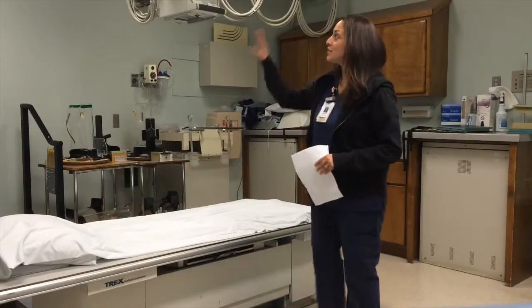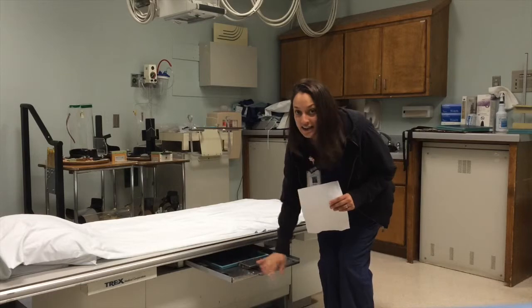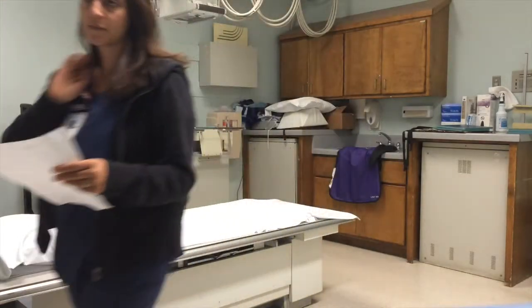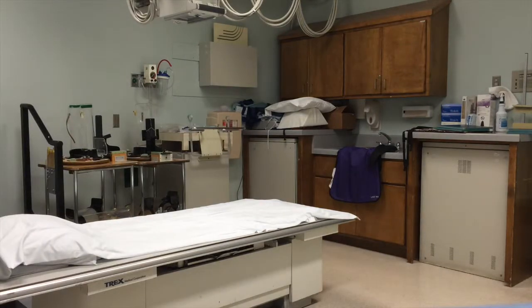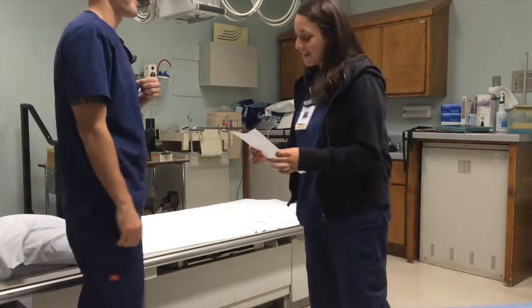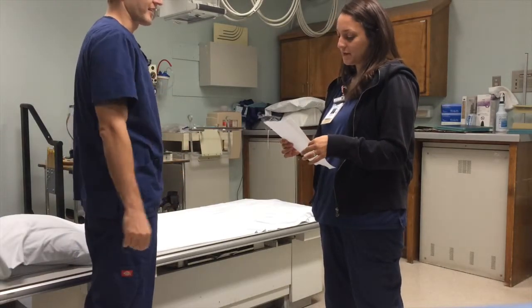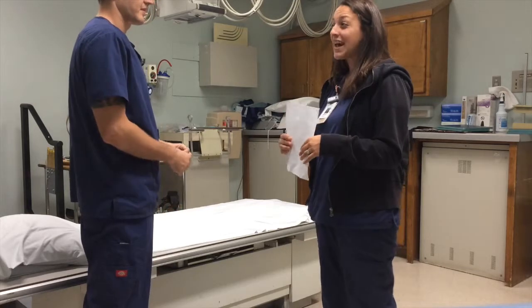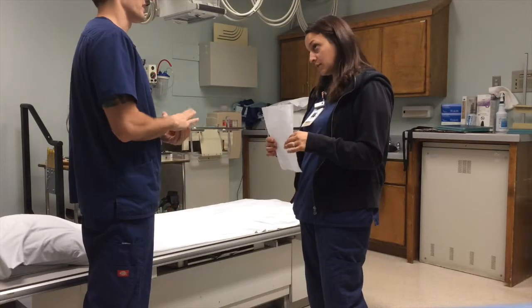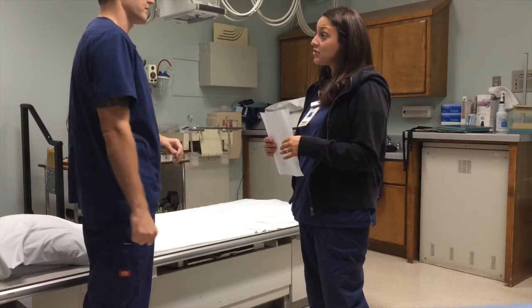Okay, so now that my tube is detented, I have my first patient here, and it's all lined up. I'm going to go get my patient. Dustin? Yes. Hi, I'm Marissa. I'm with the radiology department, and I'll be taking your images today. Can I get your last name and your date of birth? Nelson, 10780. Okay, great. And I have to ask before we get started, is there any way that you can be pregnant? No. Okay. And so it says that we're going to be taking some images of your knee.